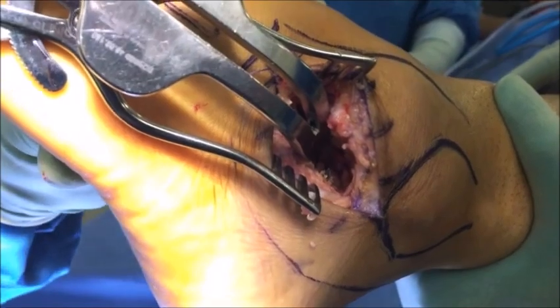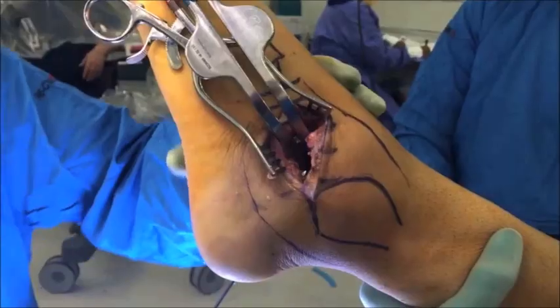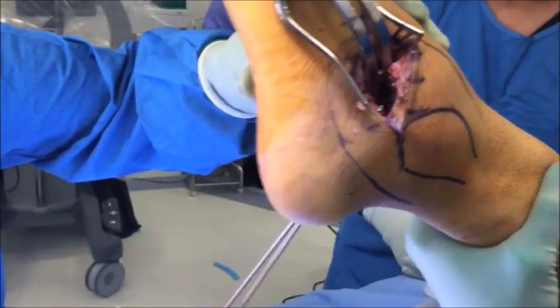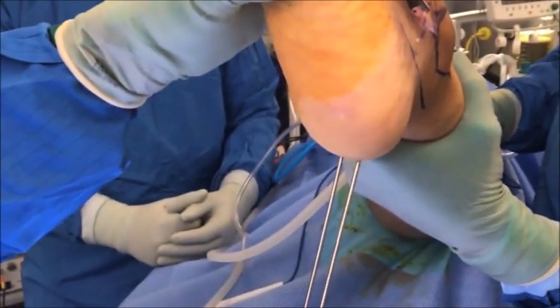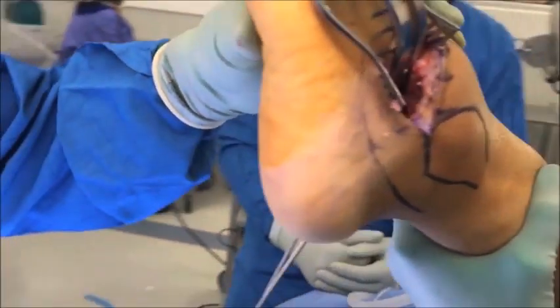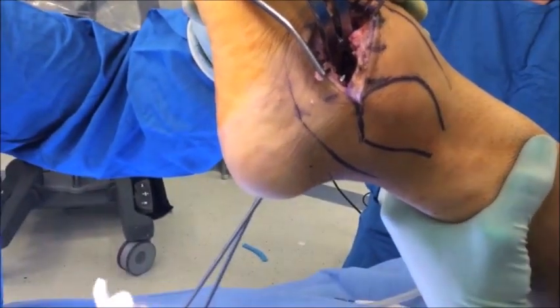A second wire is placed in the medial half of the calcaneus, aiming slightly more anteriorly so as to engage the neck of the talus. The use of an ACL K-wire guide can be very helpful in the placement of these K-wires.